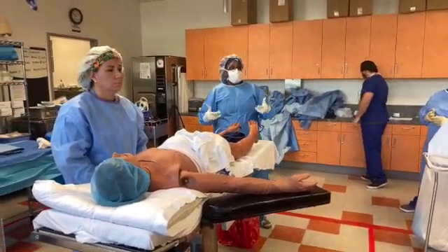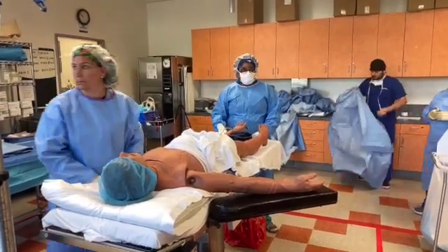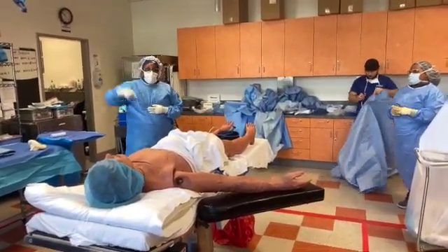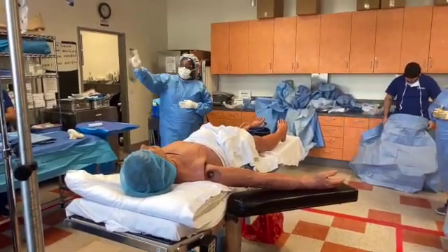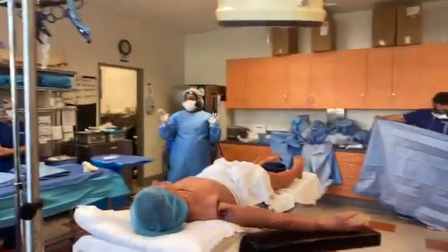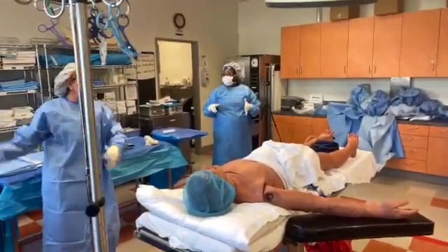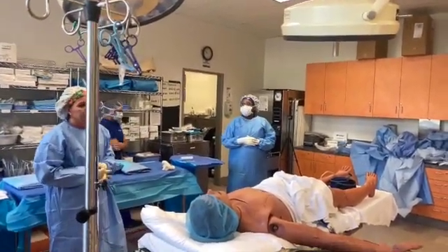Because a lot of times you're going to be the one looking where they're like, tourniquet up. And it'll be us. I usually sometimes write it down, tourniquet up, and I usually do an up arrow. Circulator's writing it up. I'm writing it here because remember, sometimes you do turnover. So on the board, off, perfect. Neural is big when they're doing different things. If the circulator's out of the room and the tourniquet goes down, you have it on your table. Yep. Any questions?